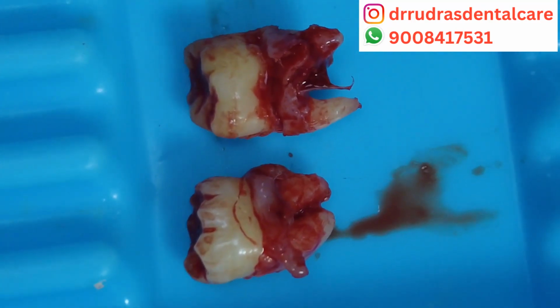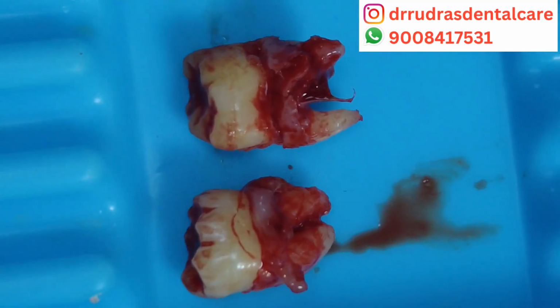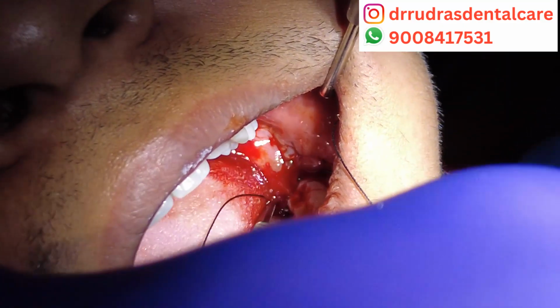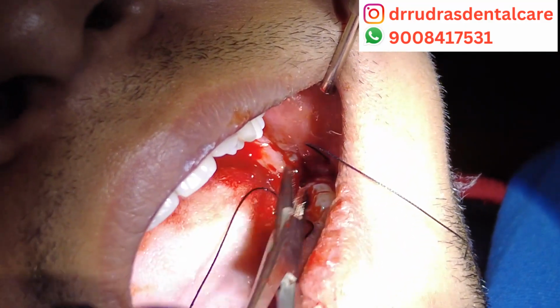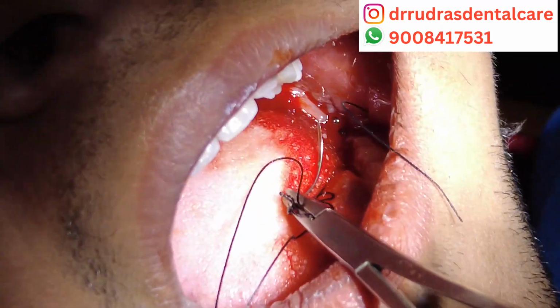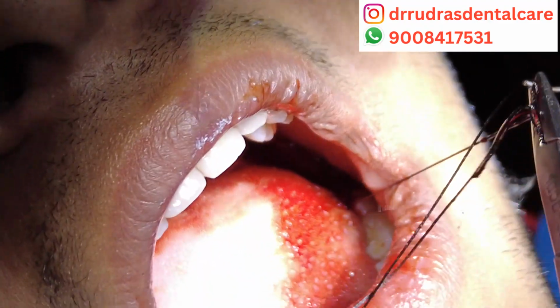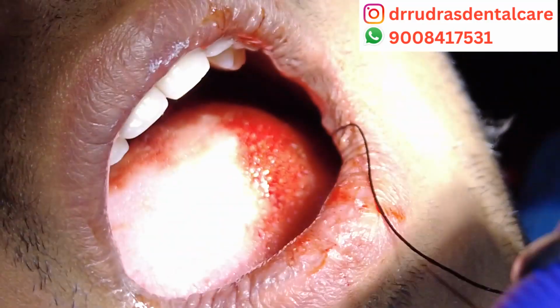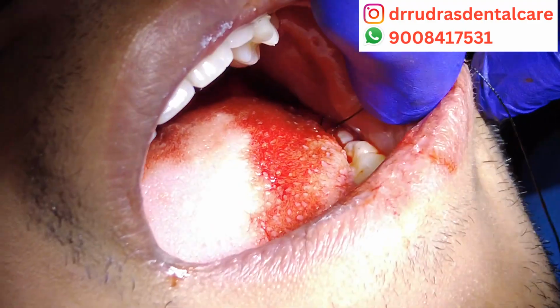And this has been a very fruitful video, because with the right principles you can avoid all possible complications of surgical extraction. Since we had opened and raised a flap, we gave sutures, and these sutures were removed 15 days after the procedure, and the patient has been comfortable ever since without any issues regarding the area of operation.